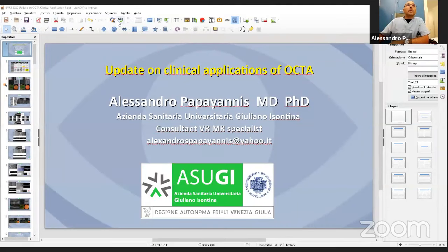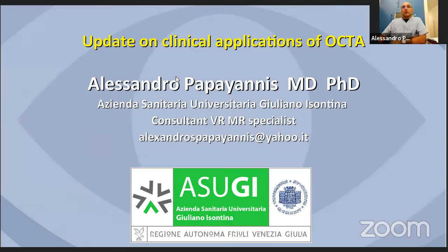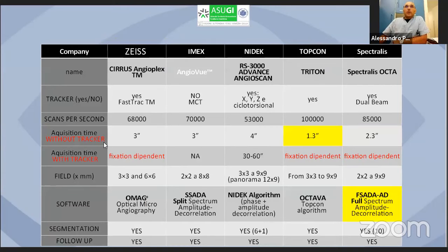Hello to everyone. Thank you for the invitation. So, the aim of this presentation was introducing the updates on the clinical application of angio-OCT. When I began my practice with angio-OCT some years ago, this was the view, the panorama, of the characteristics of the different angio-OCT available on the market.